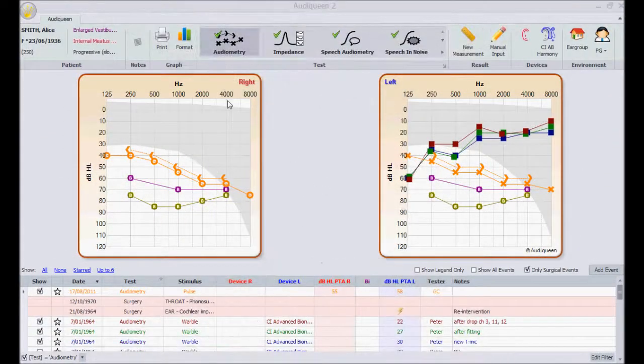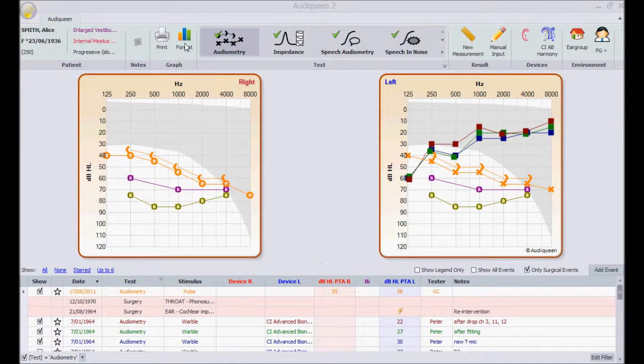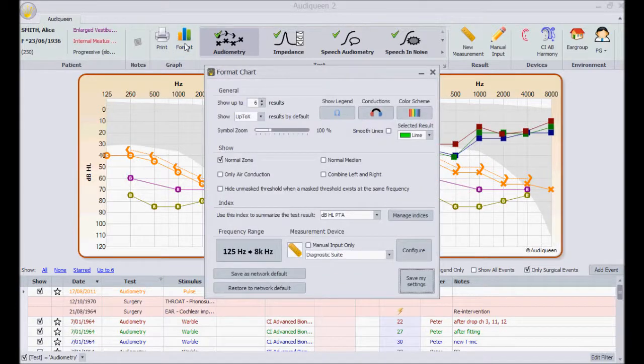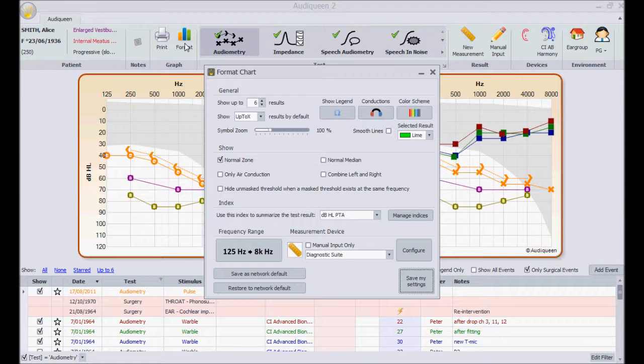The format button really allows me to customize the look and feel of my Audi Queen results. Much of its functionality is explained in the overview video. Here I'll demonstrate some additional features.